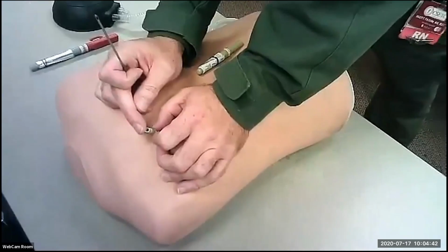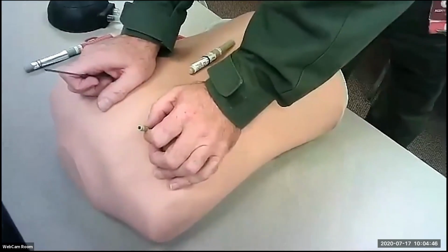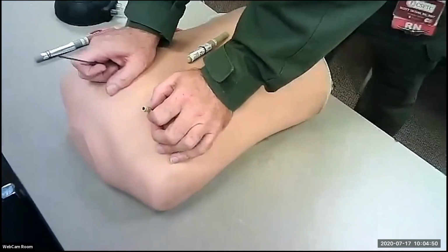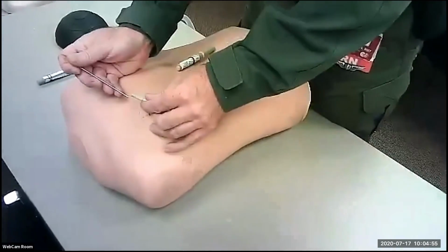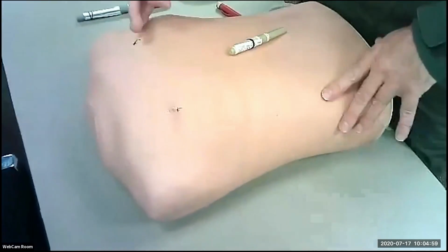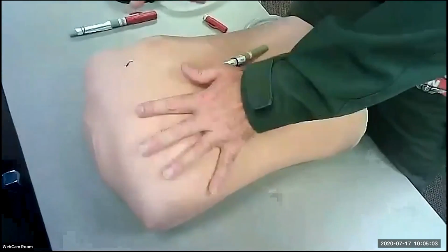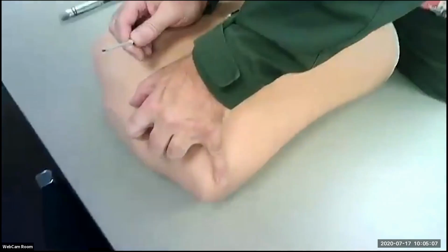Sometimes you'll get a rush of air out of this, sometimes you won't. Your biggest indication is your patient status. They're starting to talk more in complete sentences. They aren't speaking in two-word sentences. All right, assessment-wise, they're not speaking, they can't breathe. I've got one side that's going up and down, one side that's not. I determine I probably need to needle their chest, so do needle decompression.